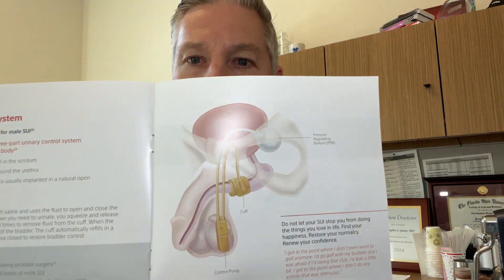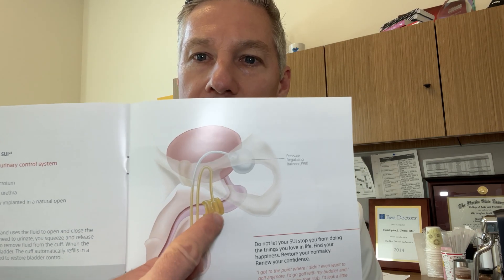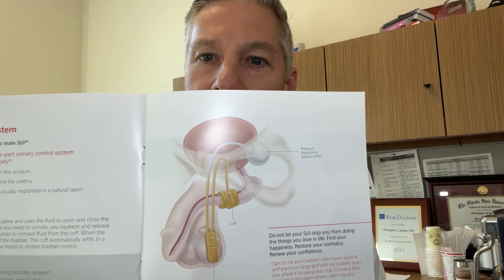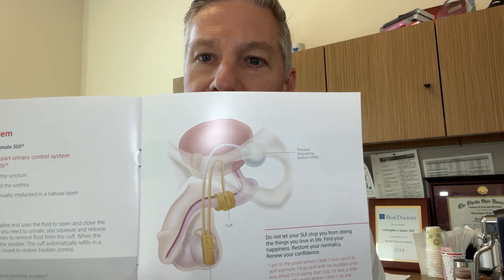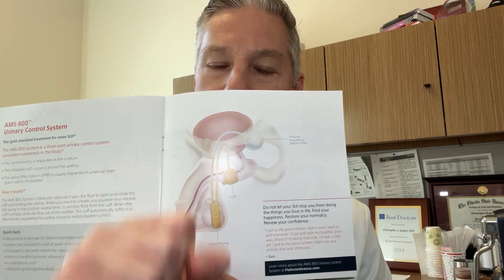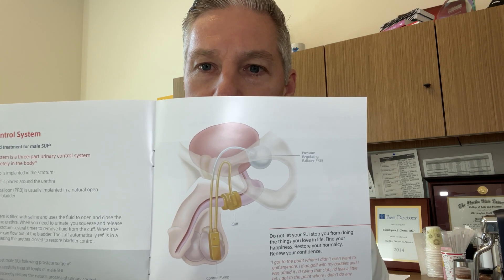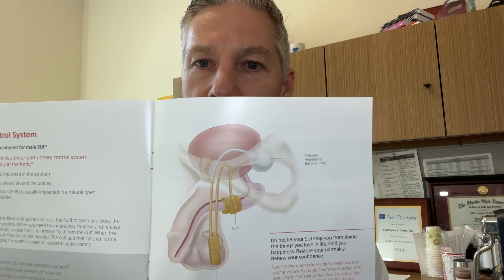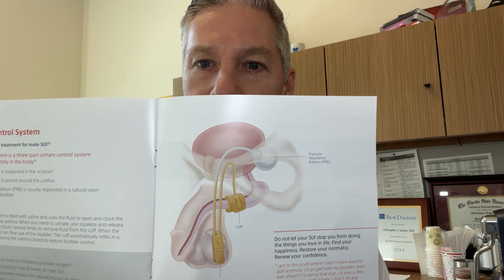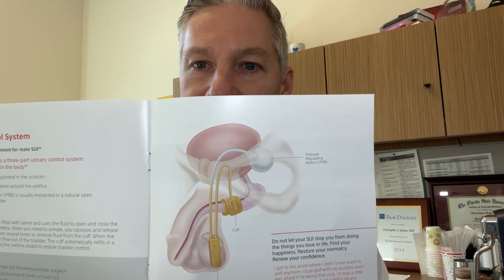Here's a schematic drawing of what the device looks like. The control pump is within the scrotum, and you can see the cuff is around the urethra. You can see from this image that it would be very difficult to insert a Foley catheter through the urethra with this cuff squeezing down on the urethra. Not only that, you can actually rupture the urethra or cause a tear in the urethra, damaging the device if you try to insert a Foley catheter without opening or deactivating the device.